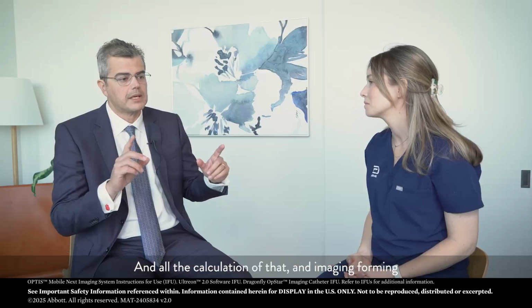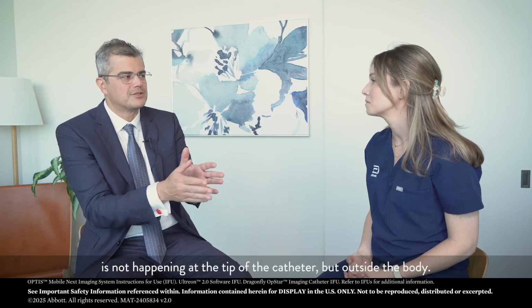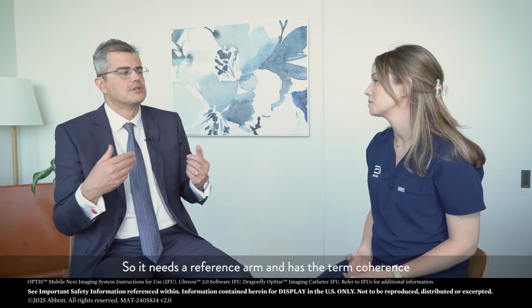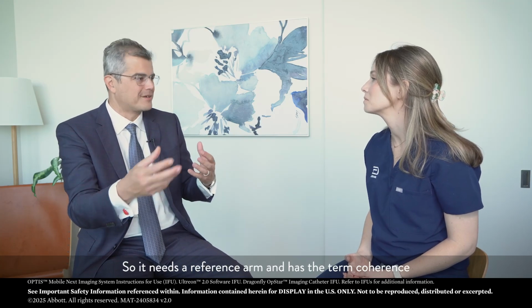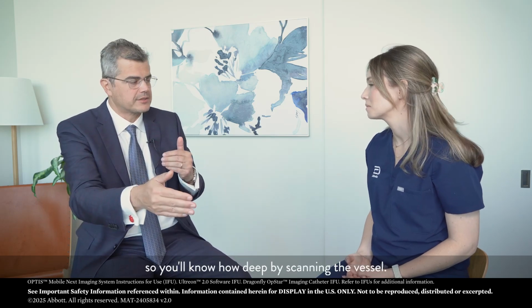All the calculation of depth and image formation is not happening at the tip of the catheter, but outside the body. So it needs a reference arm, and hence the term coherence, so you know how deep you are scanning the vessel.